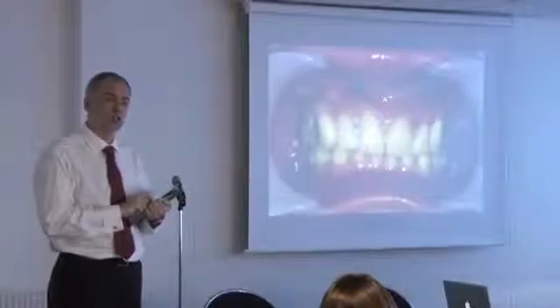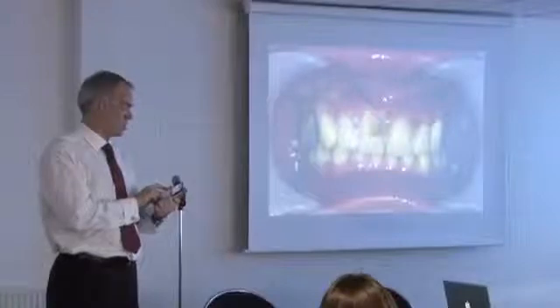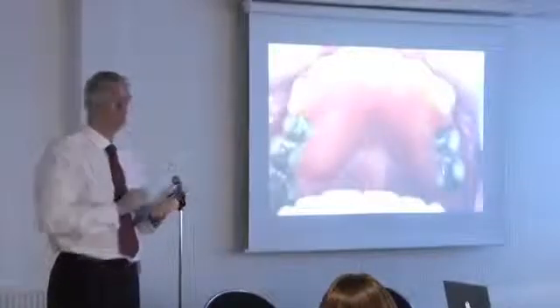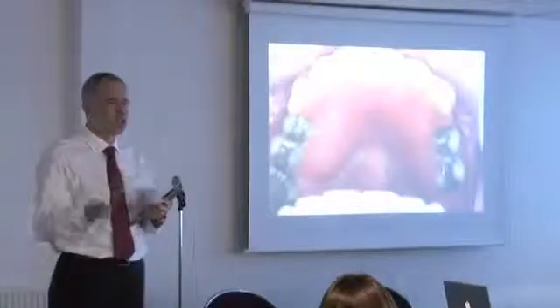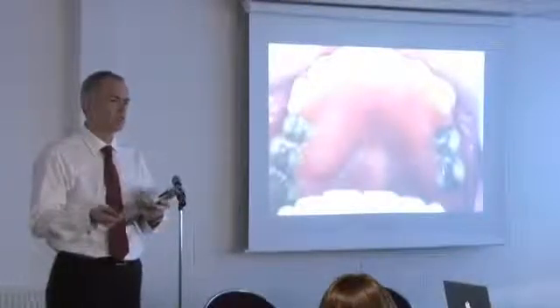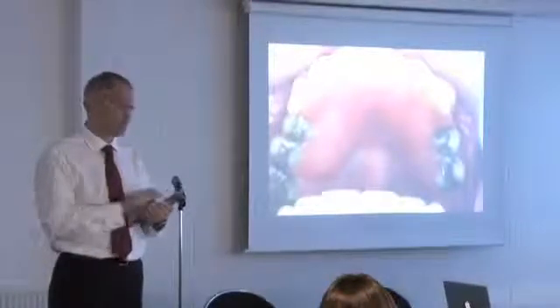And then, just as I showed you before, fit your immediate denture, because you've liaised with your technician and told them what you're trying to create. And just as before, I'm going to reline the inside of that to make sure it's a nice snug fit and it fits over those front teeth as an overdenture. So there's not going to be any rubbing, there's not going to be any pain after this. It's a nice appointment for the patient. She's improved her aesthetics instantly in one appointment.